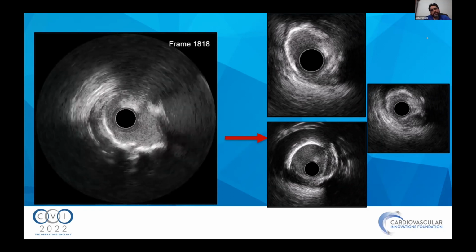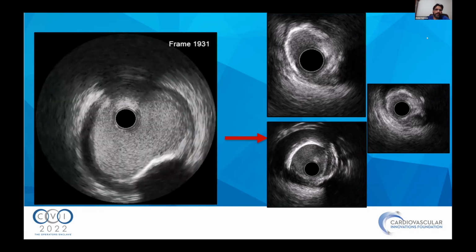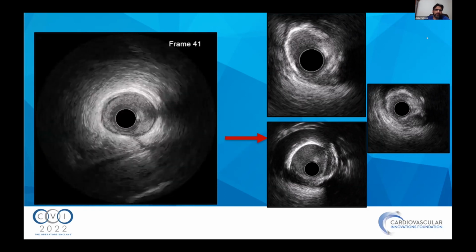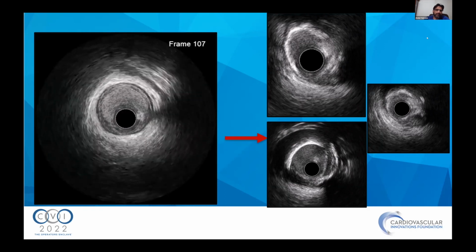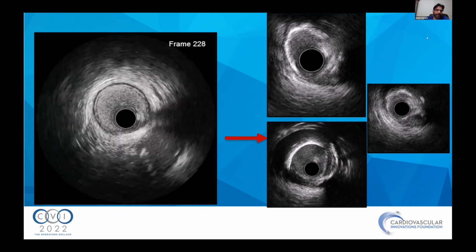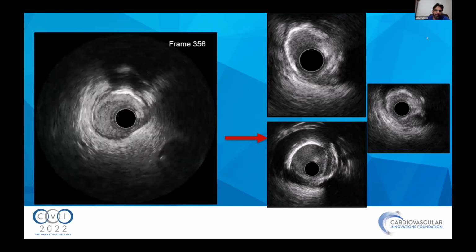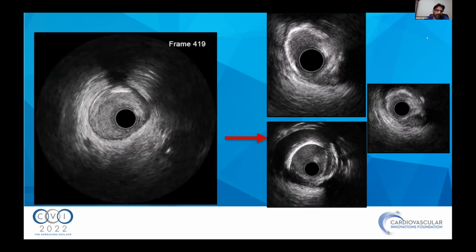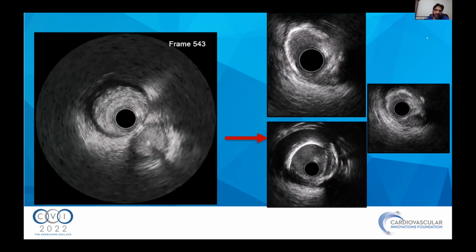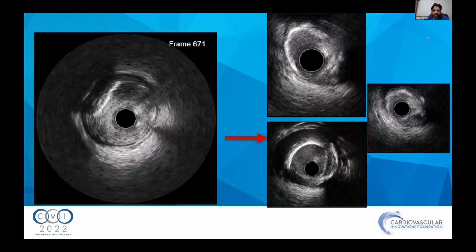I think because she's 91, I would just try a balloon, and if it yields nicely, I would proceed. Lesions that really need rotational atherectomy declare themselves. As we all know, imaging helps, but the ones that truly need atherectomy would declare themselves, especially since she's 91. If I can get a balloon to dilate nicely and put an appropriately sized stent, that would be my strategy. If this was a 68-year-old, I would be more aggressive.